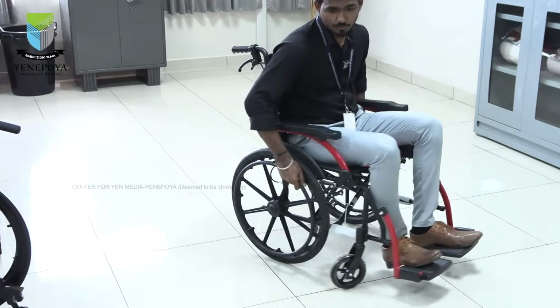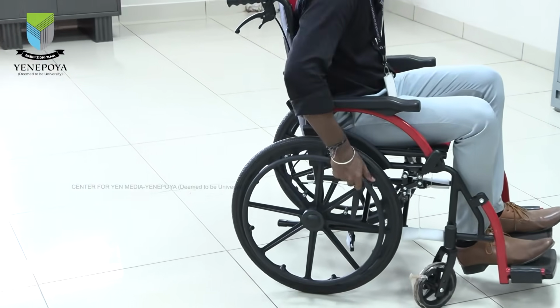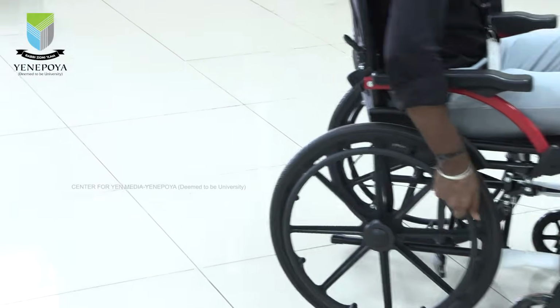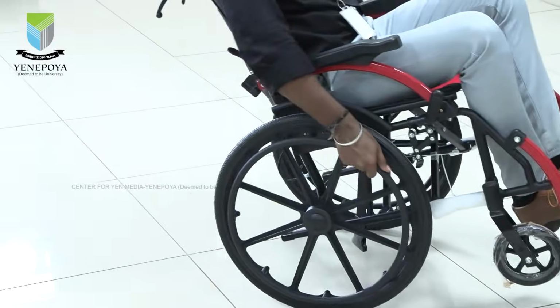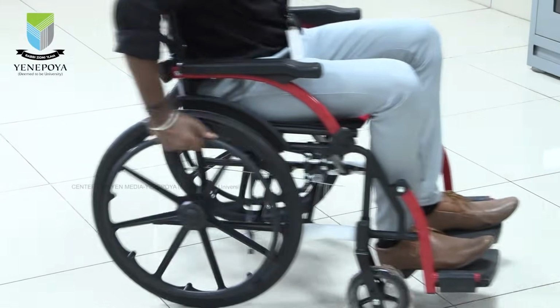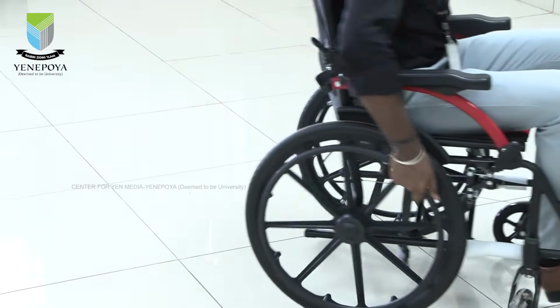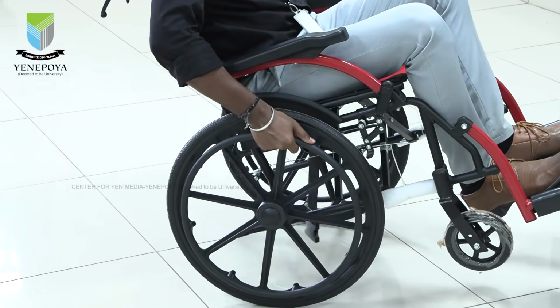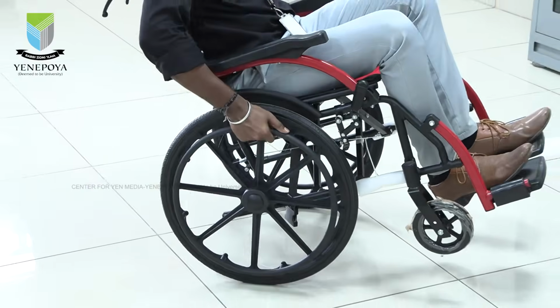So it is very simple: first you have to give pressure on this push rim, and like 1, 2, and with the force of that wrist you have to pop it up, like 1, 2, 3. After this you have to hold it in a certain way. We have seen the wheelie, but before wheelie there is one other thing we have to do first.